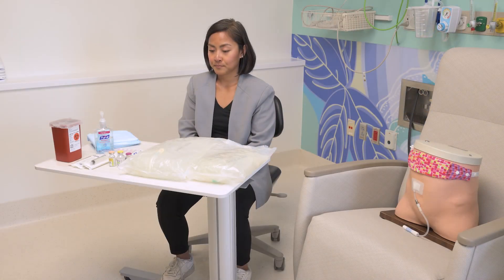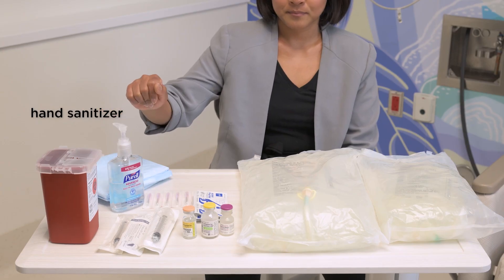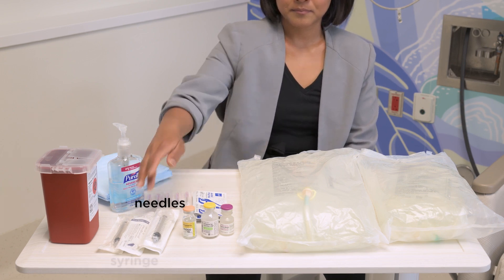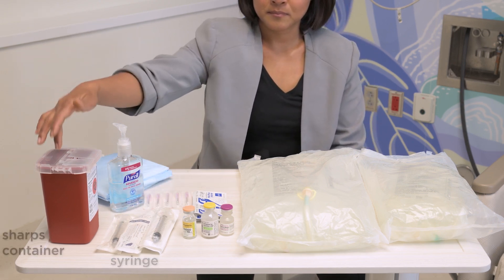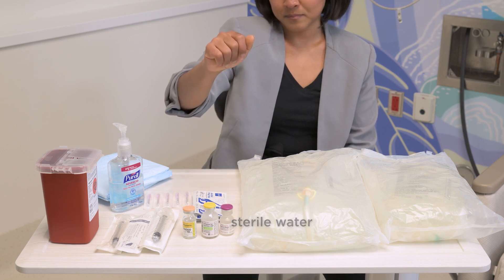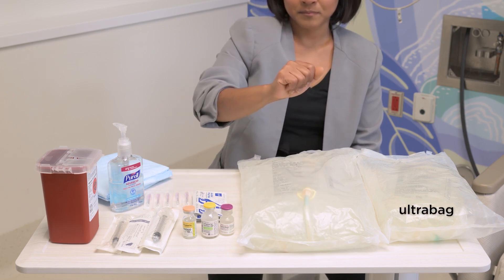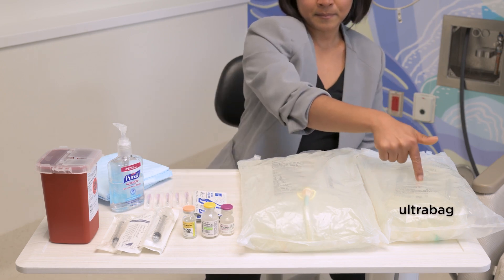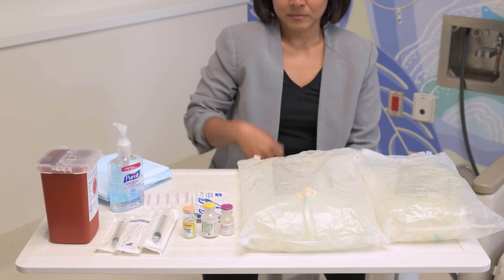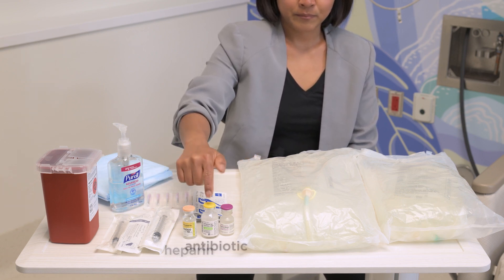You will need hand sanitizer, alcohol swabs, needles, a syringe, a sharps container, sterile water if needed, a dialysate bag, one or two ultra bags used if giving a loading dose, and the medicine to be added. This will be either heparin or the antibiotic prescribed.